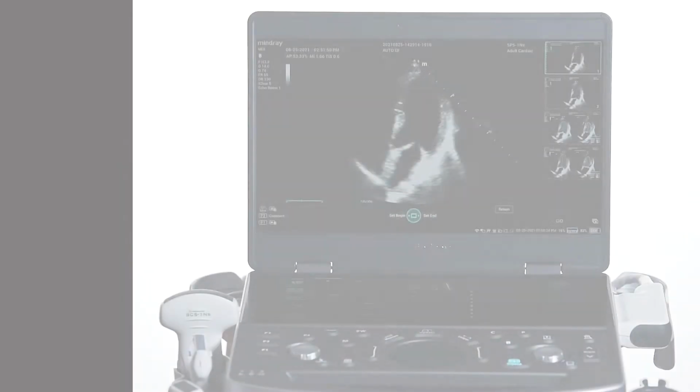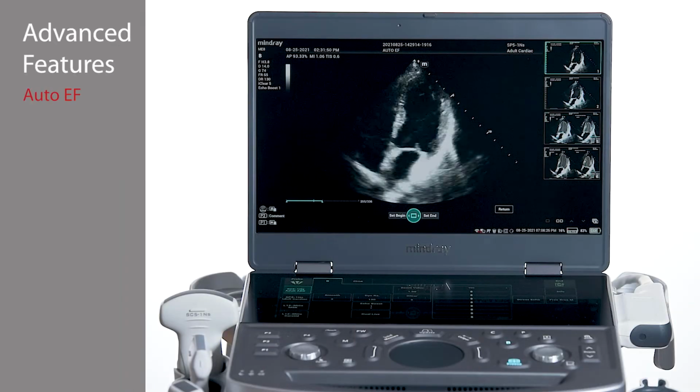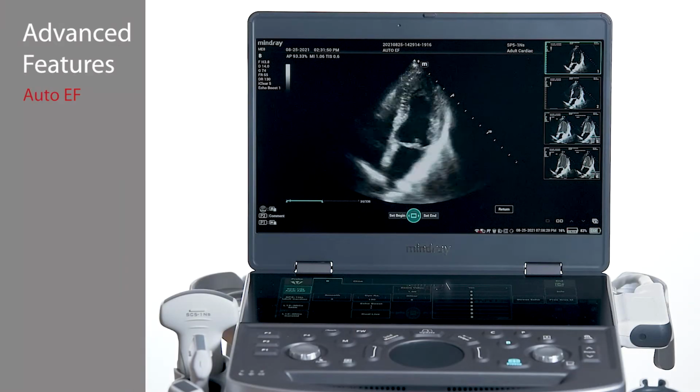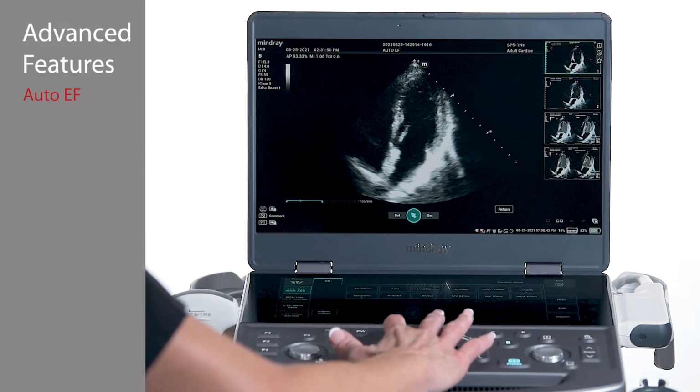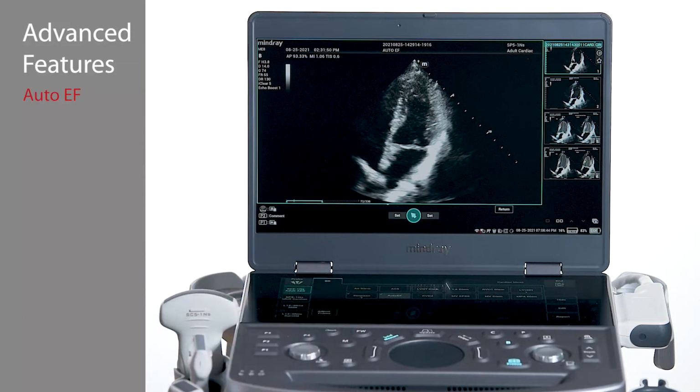AutoEF is a quick tool that provides left ventricular ejection fraction based on the Simpson's method. AutoEF can be used either on a saved clip or while live scanning. Using the phased array transducer in a cardiac exam mode, obtain an apical 4 or apical 2 chamber view of the heart, and hold the view or have a previously saved clip playing on screen.